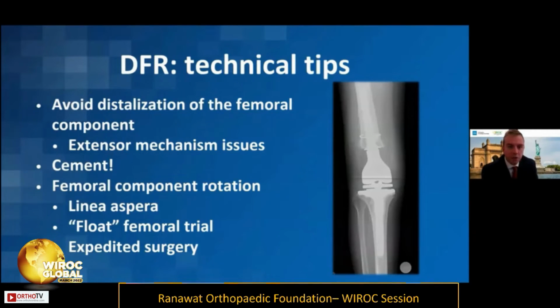Some technical tips that I think are important in these cases, and doing them appropriately: one, I think avoiding distalization of the femoral component is very important in these to avoid extensor mechanism complications that we often see with rotating hinge devices or distal femoral replacements. Really, distalizing too much puts a lot of strain on the extensor mechanism and the patella.